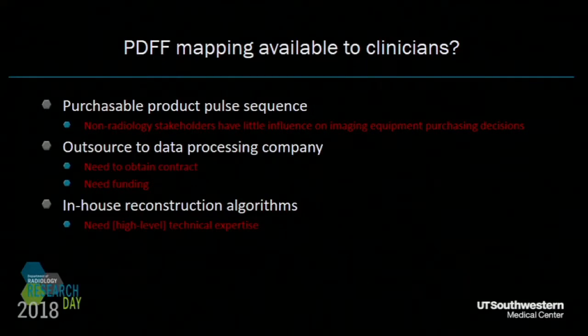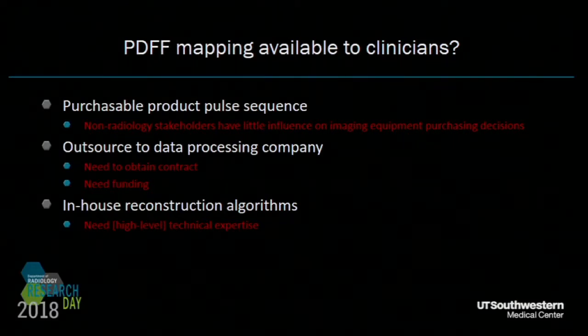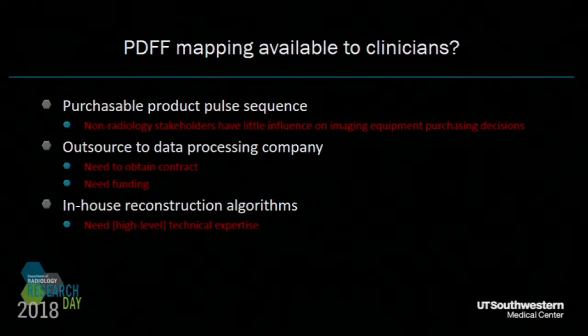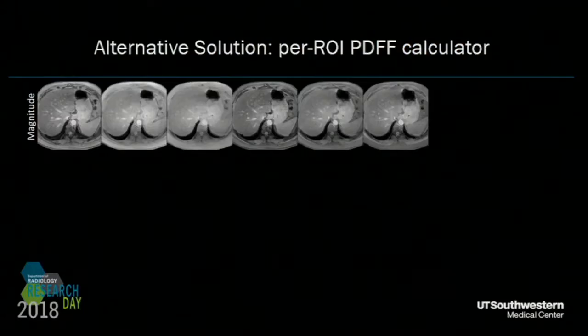Despite its utility, PDFF mapping is not widely available to everyone, primarily because community radiologists out there practicing probably don't have the technical knowledge to write their own reconstruction algorithms. And also, they can turn to vendors who have streamlined product sequences, or outsource their processing to a data processing company outside. But both options are actually costly.